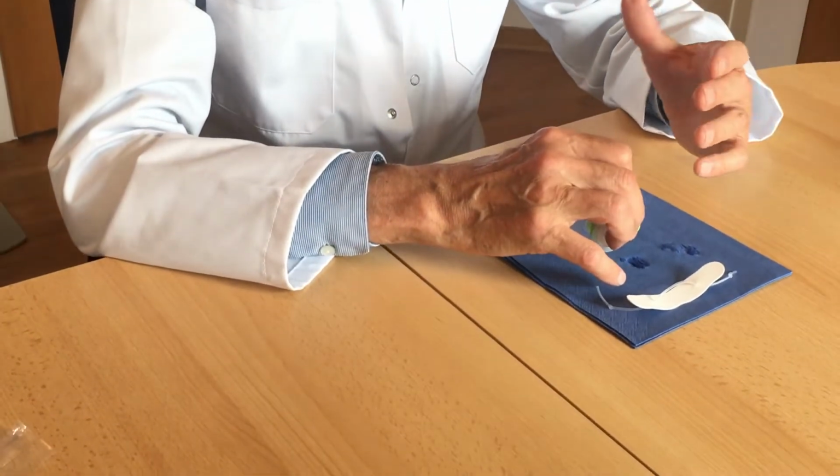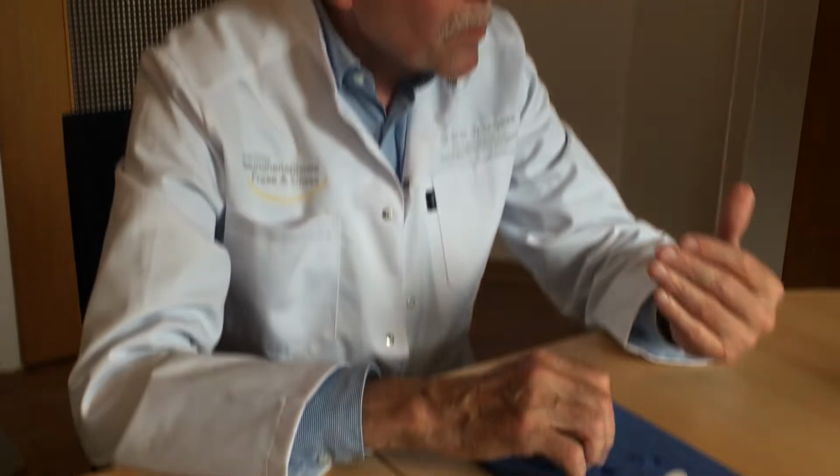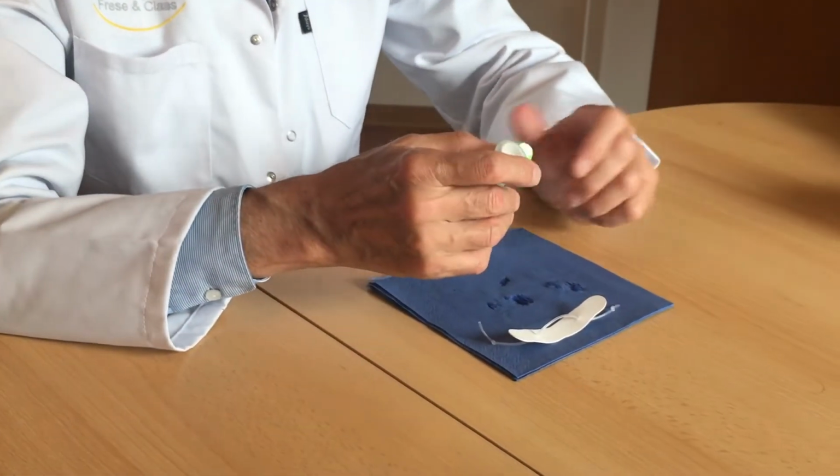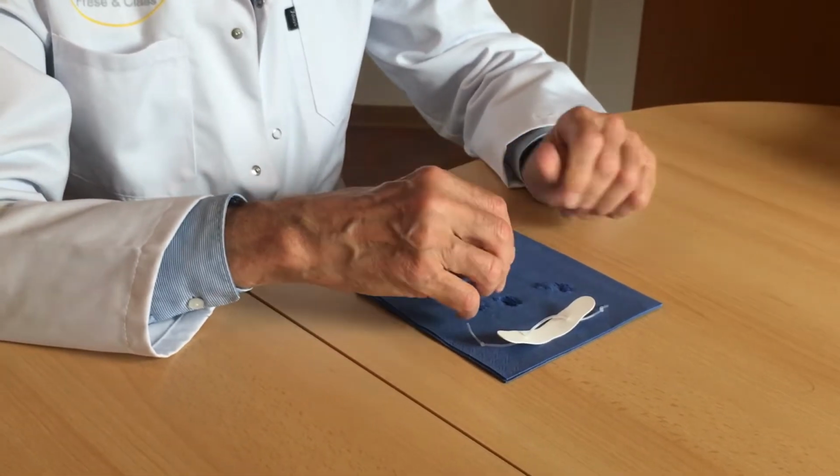But for our exercise in the long run, and to keep the tongue in its desired position, it is not necessary to have a very strong negative pressure, but it is sufficient to have a slight negative pressure which is indicated clearly by the membrane. So this is our first exercise.